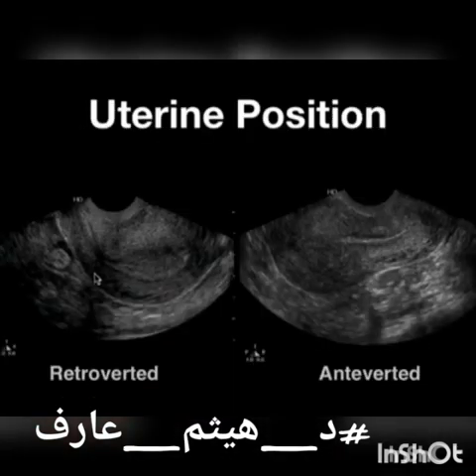Let's take a look at these two patients. On the left here, you've got a patient with a retroverted uterus. Here's caudal, cephalad, anterior, posterior. Here you've got the lower uterine segment here, and as you follow the endometrial cavity back, you can see that it is going in a posterior direction, so this is a retroverted uterus. Here you've got caudal, cephalad, anterior, posterior, and you can see following the endometrial stripe up to the fundus here, it's in an anterior direction, so this is an anteverted uterus.